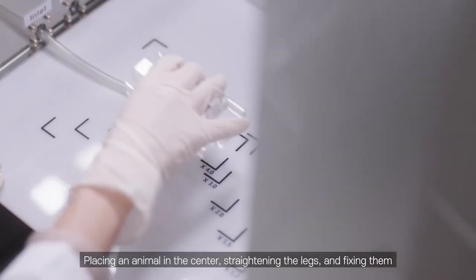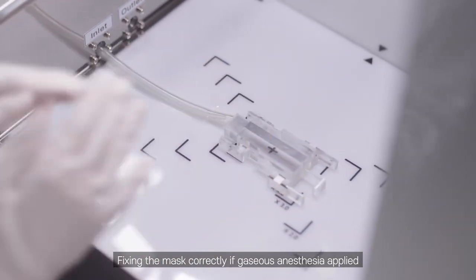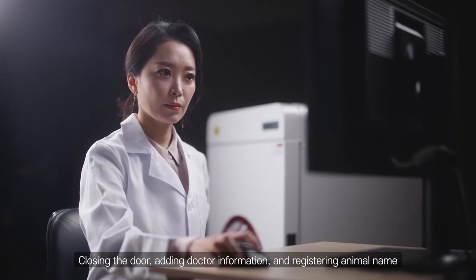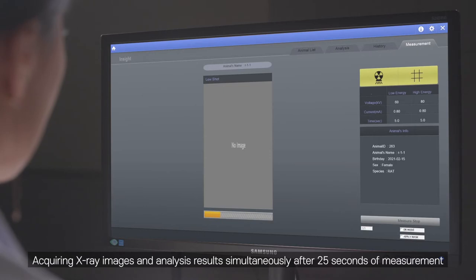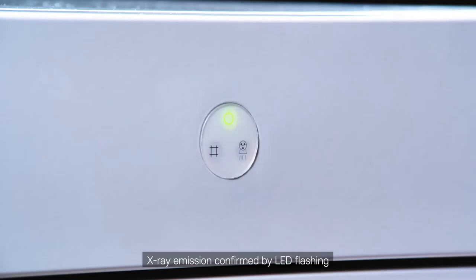Placing an animal in the center, straightening the legs, and fixing them. Fixing the mask correctly if gaseous anesthesia applied. Closing the door, adding doctor information, and registering animal name. Acquiring X-ray images and analysis results simultaneously after 25 seconds of measurement. X-ray emission confirmed by LED flashing.